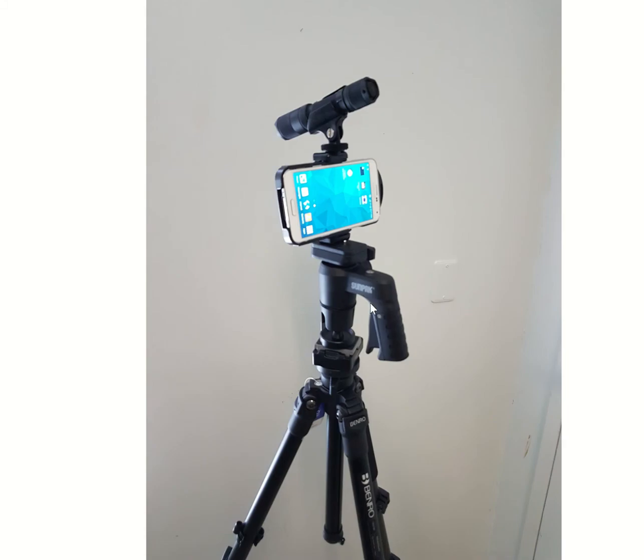We also offer an optional pistol grip ball head that allows you to easily adjust the angle of the Forensic Cam or Forensic Cam Plus during viewing and image capture.